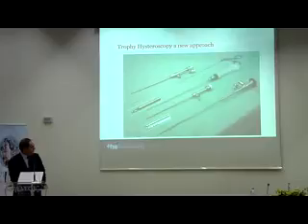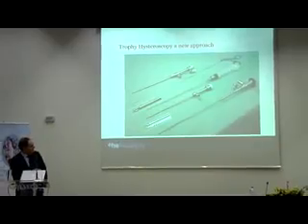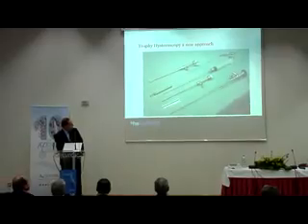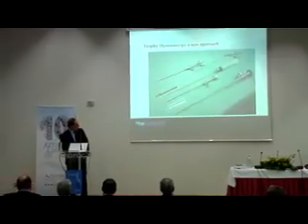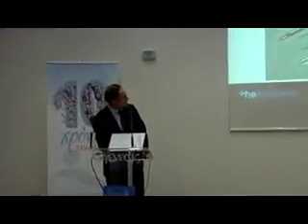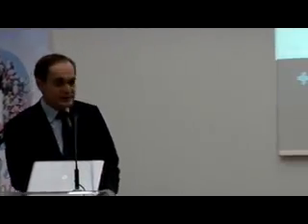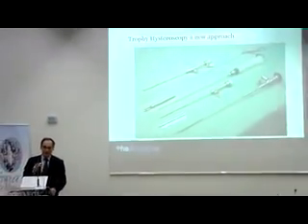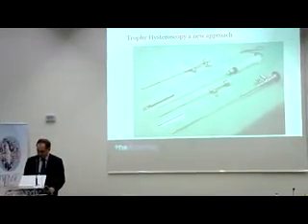You have a very automatic tip, and then you can put accessory sheaths. If you put the sheath, the diagnostic one, it comes until there, and you have 7 centimeters of free room. If you put it forward, you get double flow, but you can also do a D&C. You put this in, you take out your scope, and you have a D&C. So you can do a D&C without putting a speculum, without traumatizing the patient.